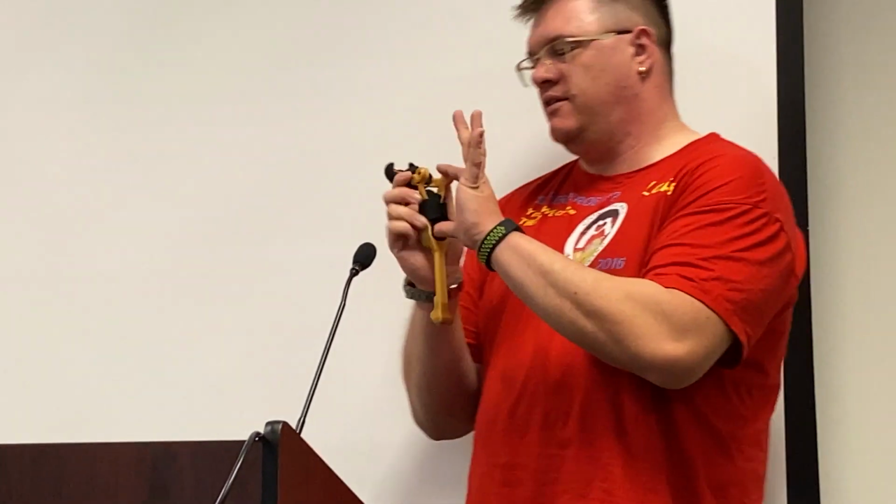When I did the stork, it was a little bit tricky because the stork had just this much of a lower leg, you missed much more, and this hinge is just for positioning it right, so it will not turn. With this, you can always do engineering tricks, like the stork always walks on, what's that called, concrete. So this will wear down, and if I print this in a whole piece, I have to reprint all of this. So I'm a lazy engineer. I say, you know, I don't want to print that much, so I just made this little piece here removable. You just unscrew it and tell me you need another foot, and you get another foot. So it's always thinking out of the box.